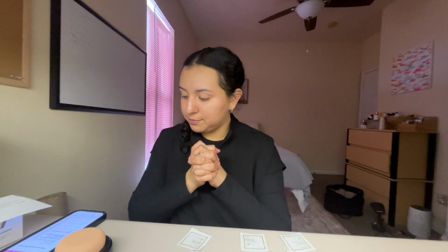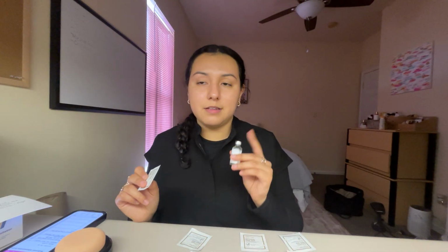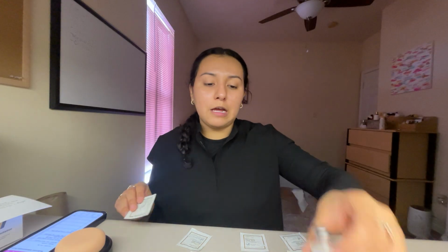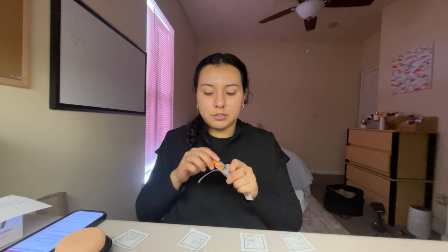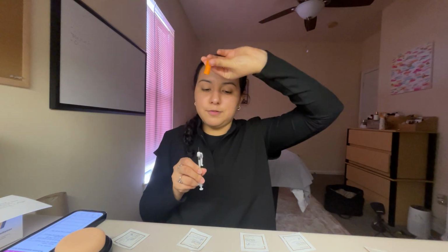Now I am going to go ahead and check my supplies. Alright, so for my multi-dose vial, I have insulin. So I'm going to make sure that I wipe the self-sealing stopper top with my alcohol swab. I'm going to swab it, and I'm going to allow that to dry. And then as that's drying, I'm going to open my insulin syringe.